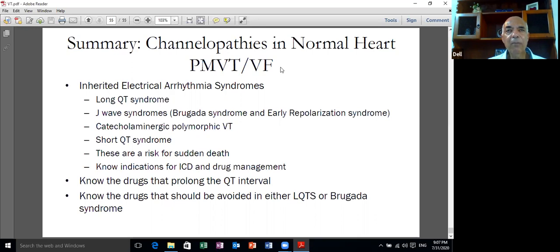Remember, with the wearable defibrillator you cannot take a bath, so sometimes it cannot be worn all the time, so that decreases its efficacy. But I think it's a class 2B recommendation to be used. It's more commonly used in Europe than in the States, but it has not been cancelled. It's one of the methods by which you can overcome the problem of the first 40 days.